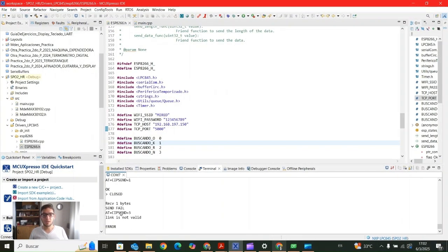So now, as you can see, in the console, in the terminal, we see when we have the connection properly, the different messages that are being sent to ESP and the data that was being sent. Now we have some errors, okay, typically because we shut down the connection, so it's like trying to send something and it's not receiving any response from the computer, so it says error.